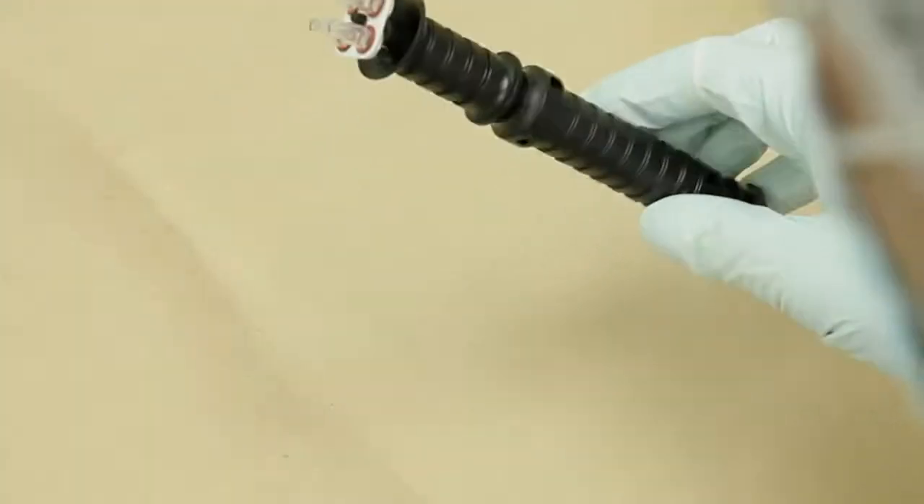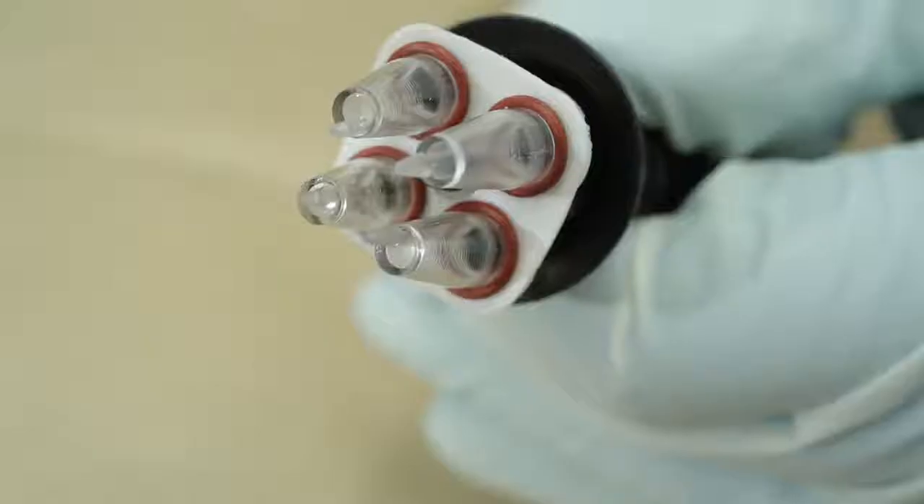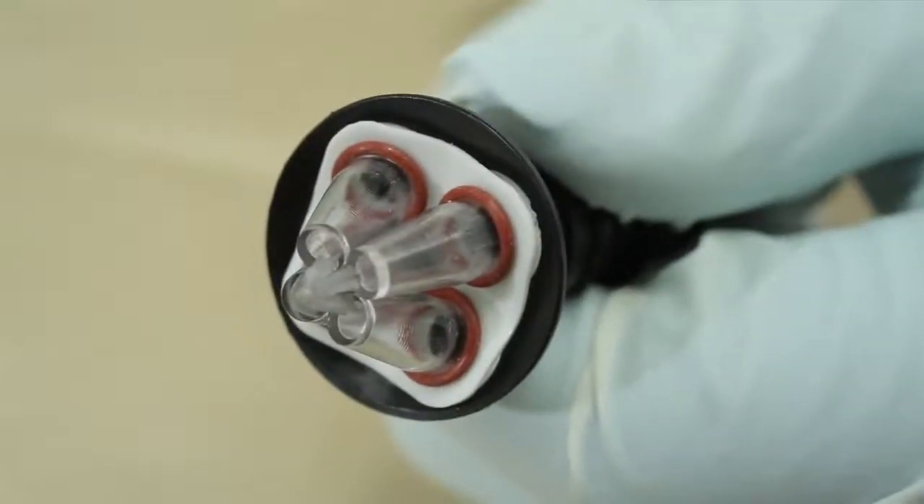After taking the sample collector out of the packaging by the handle, the four nibs become one by pushing the collar forward.